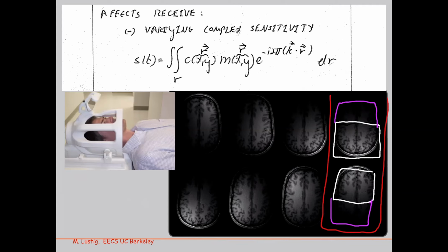What would happen if I cut my phase encode by a factor of 2? Mickey, the question is not so clear, at least to me. What do you mean by cut the phase encode by factor of 2? Well, okay, to get this entire field of view, I need n phase encodes. But instead, I do n over 2 phase encodes with more spacing.